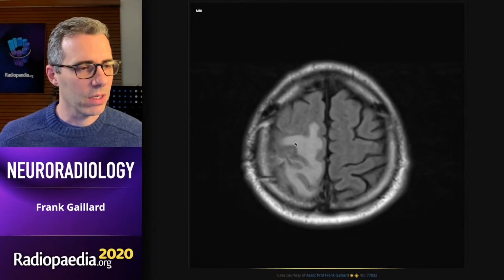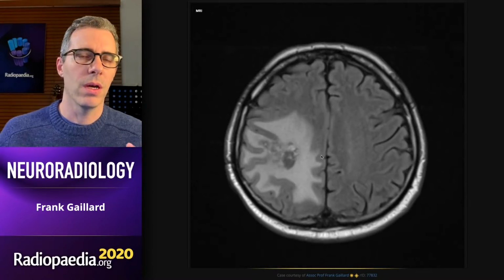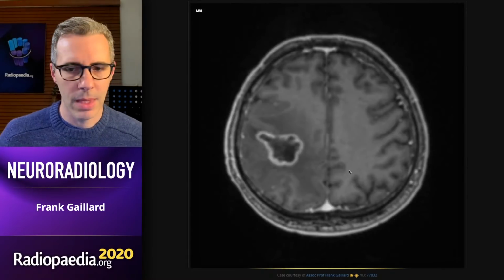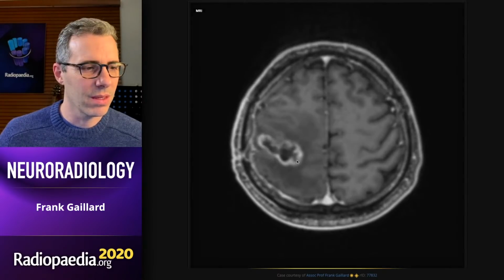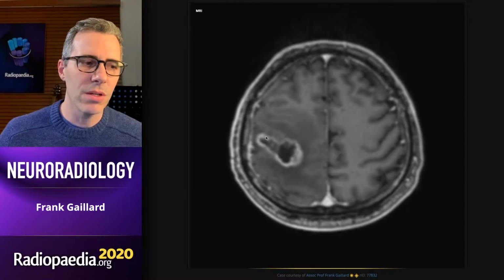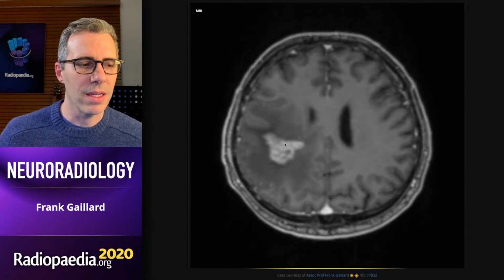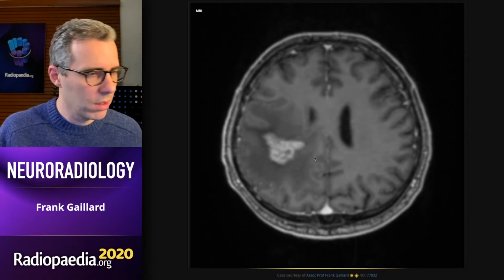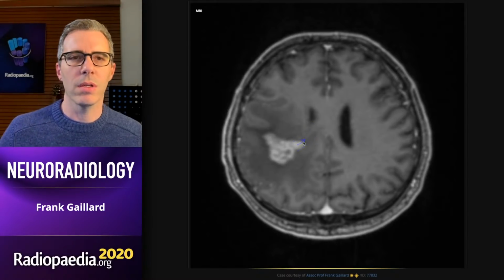So if we look at this patient, well, there's a lot of vasogenic edema. Notice how now it's much more evenly spread around the resection cavity. And if we have a look at the post-contrast, that looks pretty nasty, right? There's some maybe solidish components, but note that most of it is fairly thin and rim-like enhancement of the cavity. The one area that's concerning is down here, where it is more nodular. We'll come back to that. And notice that tongue of tumor. Remember how there was just vasogenic edema heading down there? Notice that there's now some enhancement going down there.